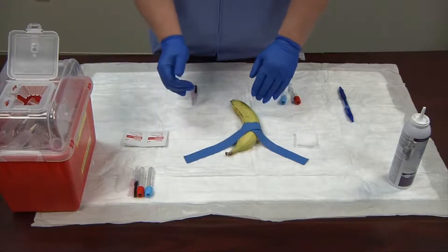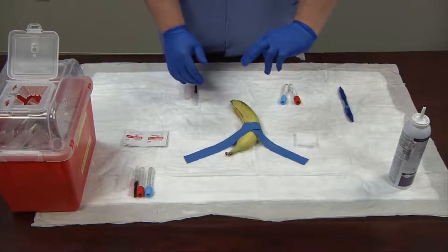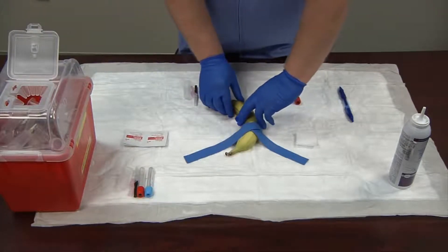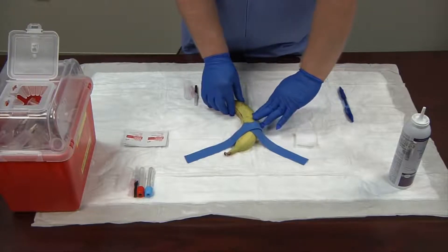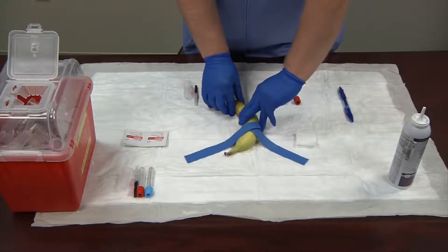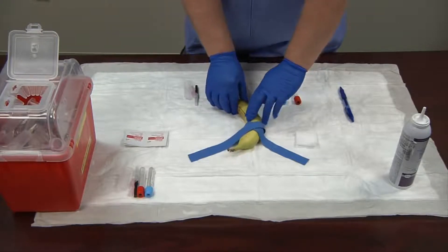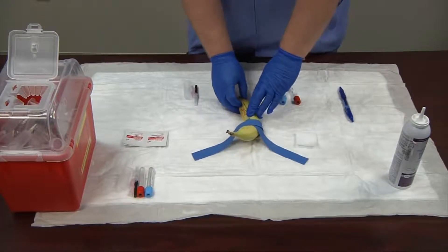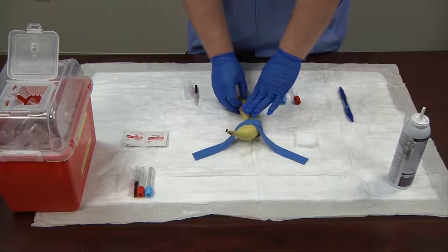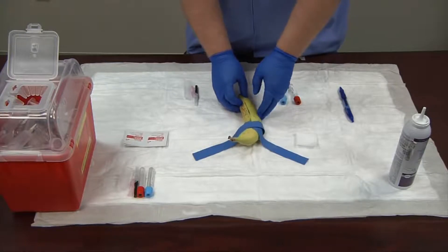I have my tourniquet on and I begin to palpate. As we palpate, we use our two non-dominant index fingers, going over one side, feeling over, coming back across, and picking the vein we'd like to use. We'll go right here. Now I'm going to do a landmark — you can use body skin features such as freckles or little pimples, or you can take your thumbnail and press gently to make a small mark to save your spot.